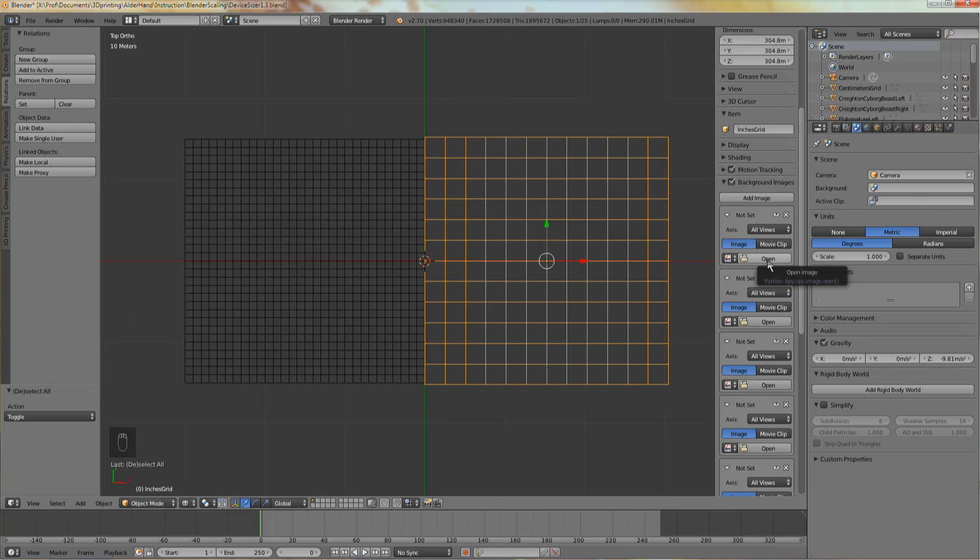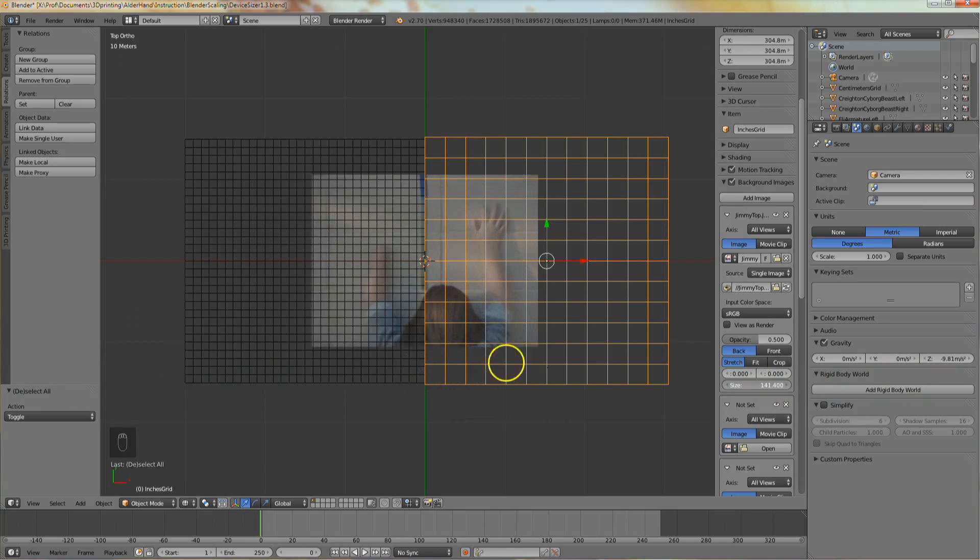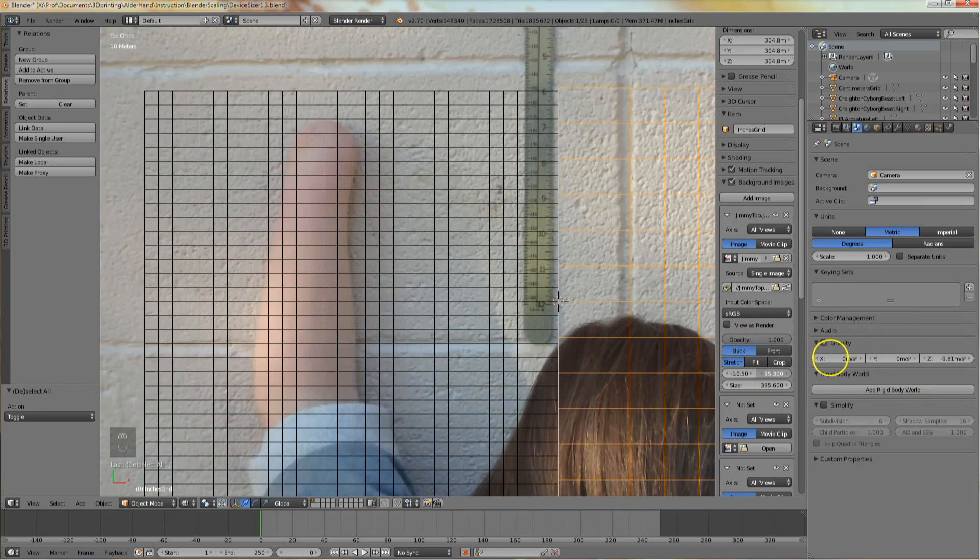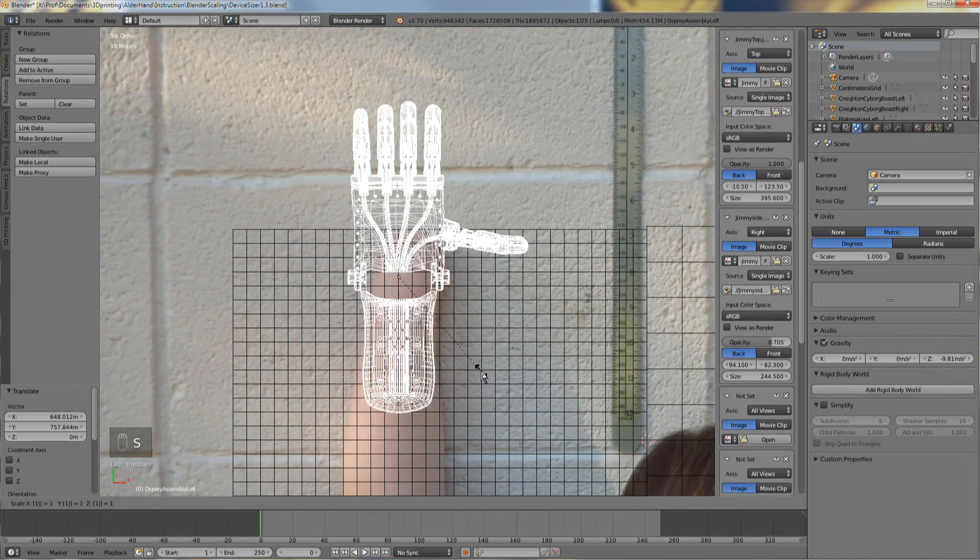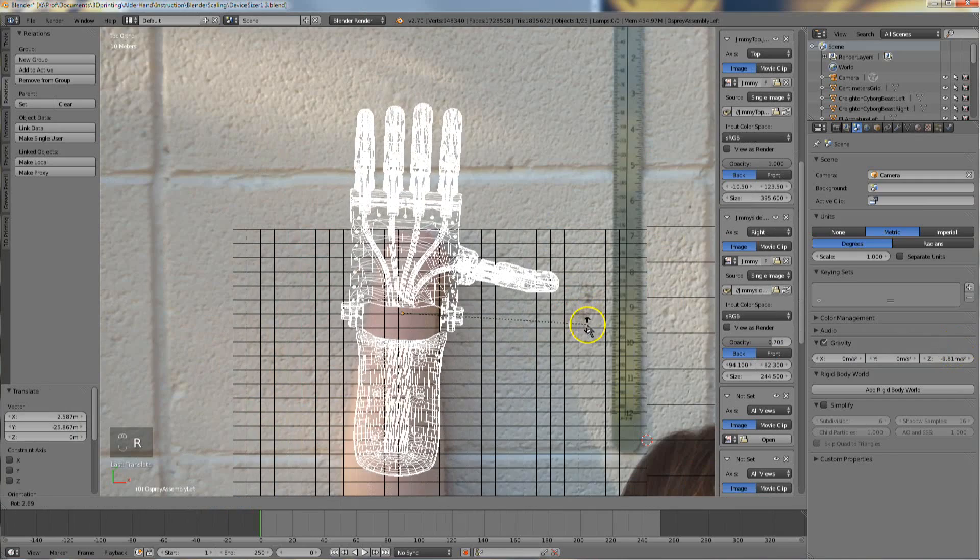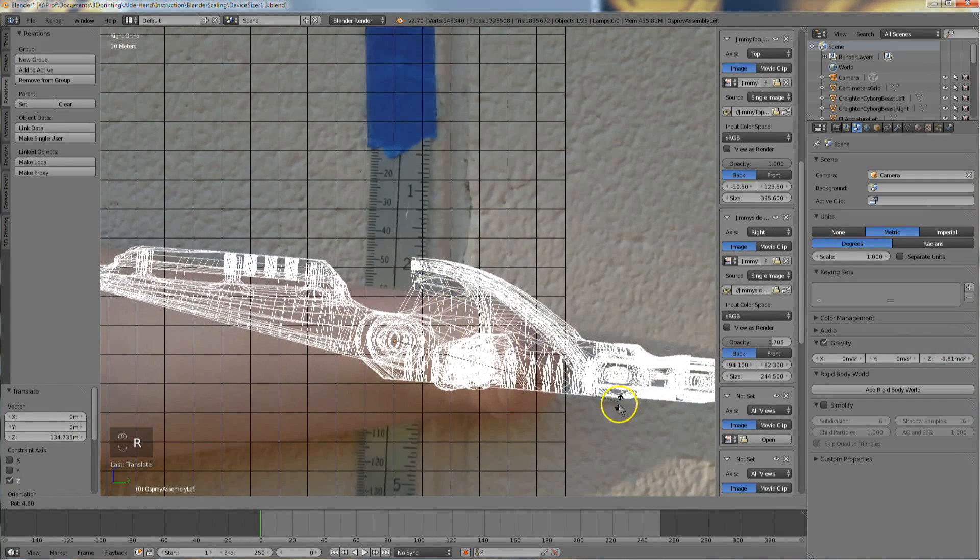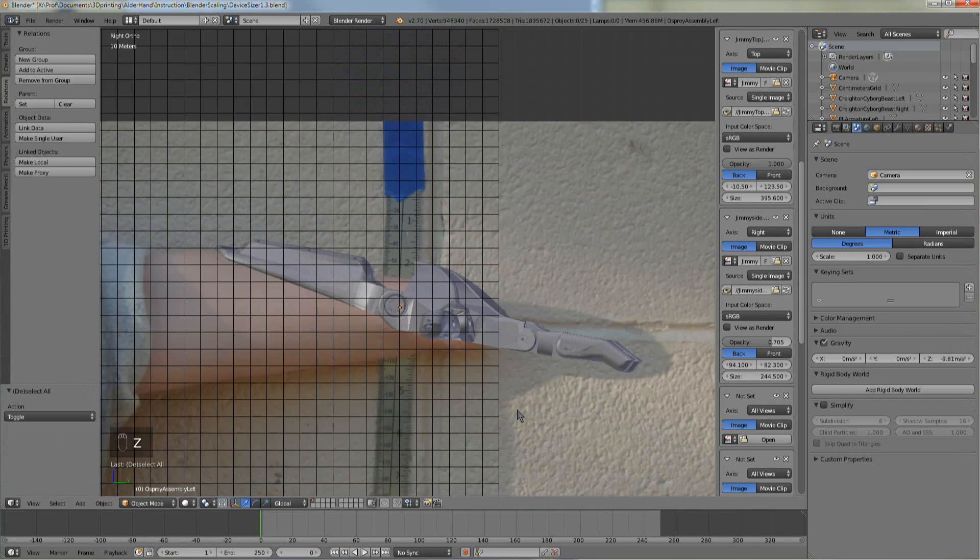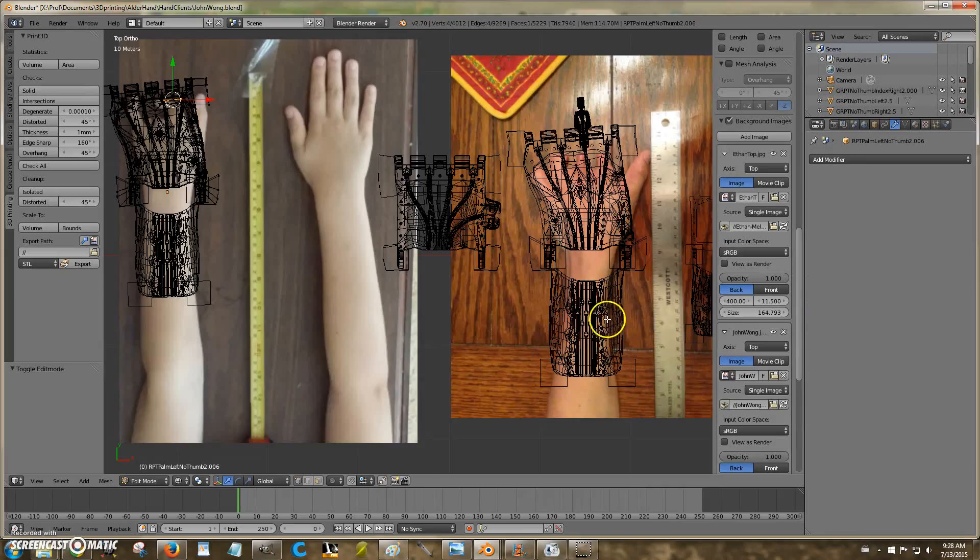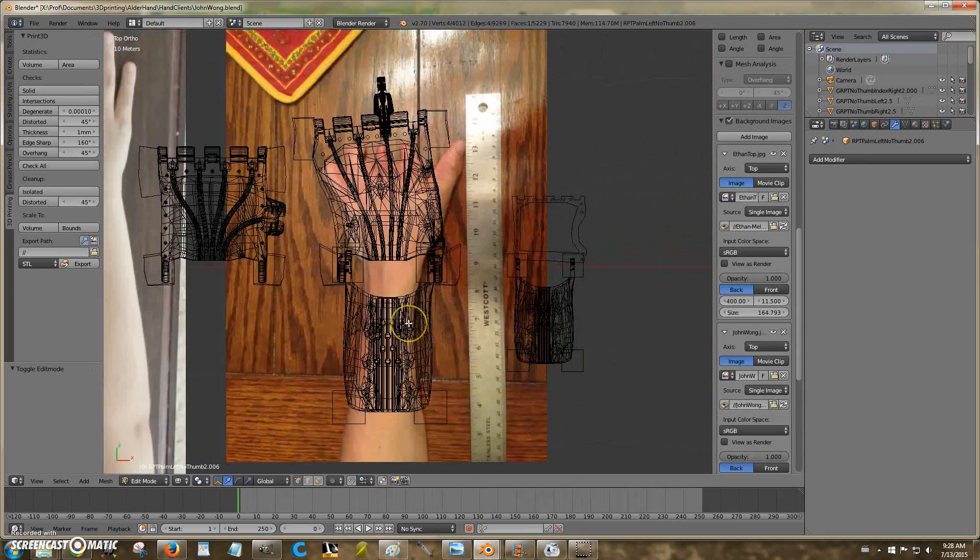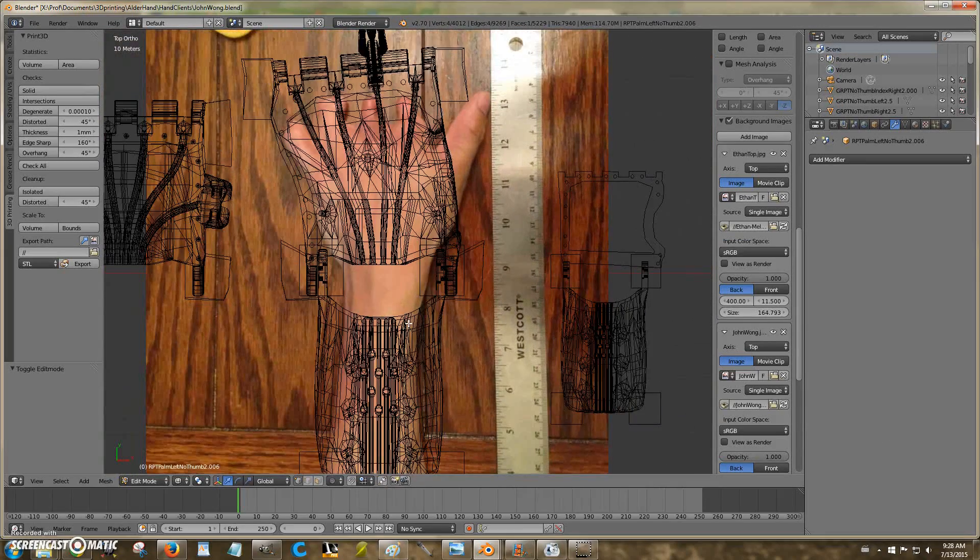In this video, we will be importing, scaling, and aligning images in Blender to help with the fitting of an upper limb prosthetic. Bringing photos into the Blender space makes it easy to scale and model designs around the anatomy of your client.